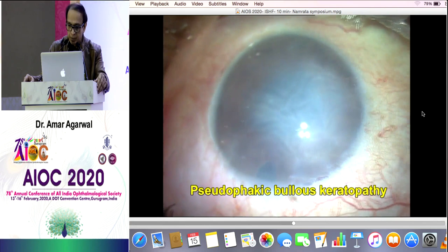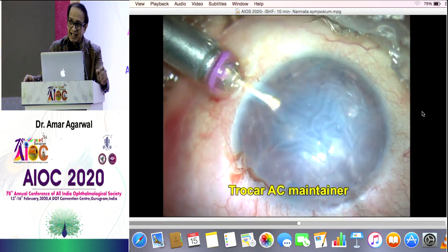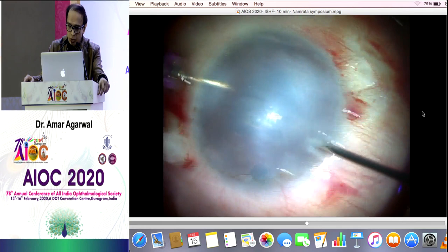This patient was referred to me by the president of AIOS, just previous one was Dr. Natarajan. You can see this patient was operated 6 times. Okay, the reason I'm showing you this for ISHF is basically, can you do it in such crazy cases? See the bad scarred cornea. And this patient has come from Bombay, wanted to commit suicide. So when Nutty called me up and sent the patient to me, I asked him to send the patient over.